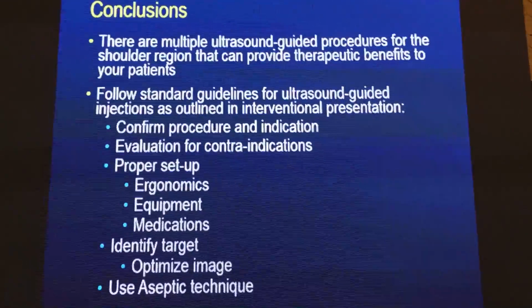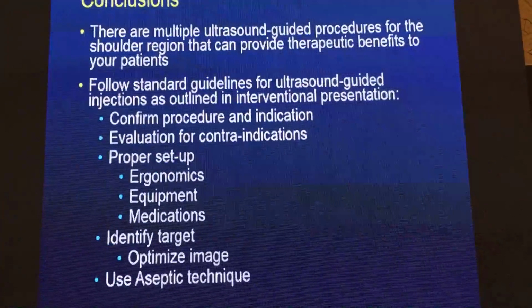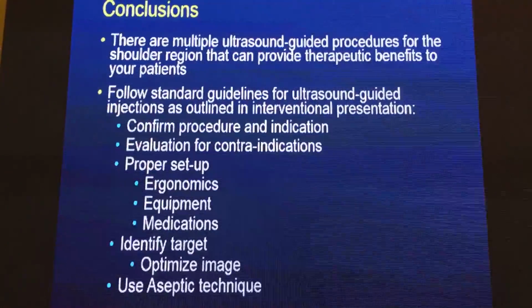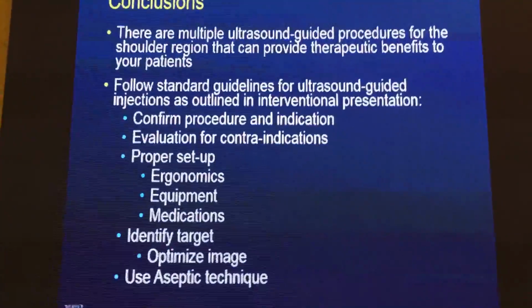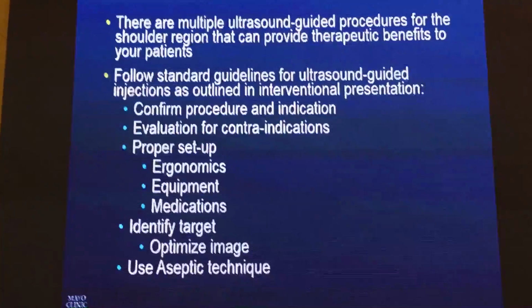Some people use the no-touch technique. I'm not opposed to that, but if you get an infection, it's not a good thing. I make sure that it's the right tool for the job, so fluoro's better for some things, ultrasound's better for other things. I make sure that I optimize my image and I get my needle in the right place and I confirm its placement before I inject my injectate. And that is how I do ultrasound-guided procedures.